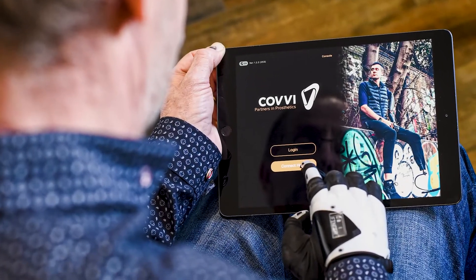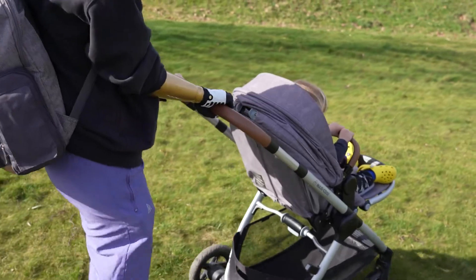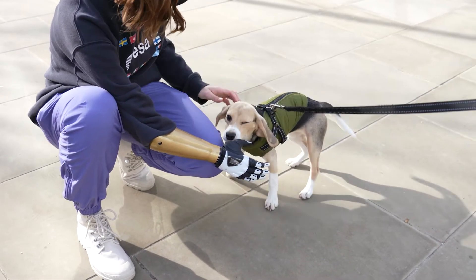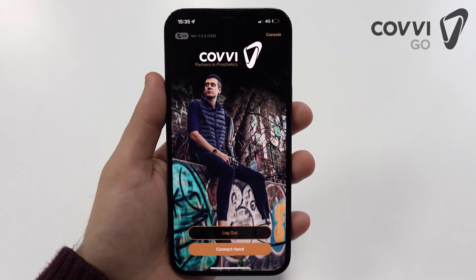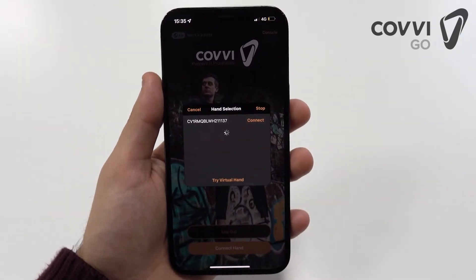The COVVI Go app is the control center for the Nexus hand. It allows for customization of the hand to suit the lifestyle of its users, so that the hand works with them. With the attractive design and simplicity of the hand selection screen, users can connect their hands with ease.